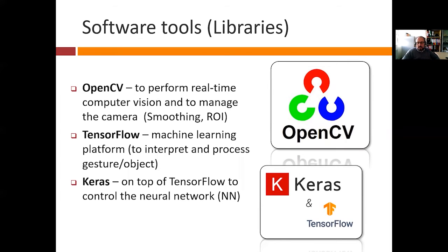And we use TensorFlow, which is the famous machine learning platform, which allows us to interpret and process, in this case, the gesture recognition, the object or objects. And on top of TensorFlow, we also use Keras, which allows us to control the neural network, the convolutional neural network.